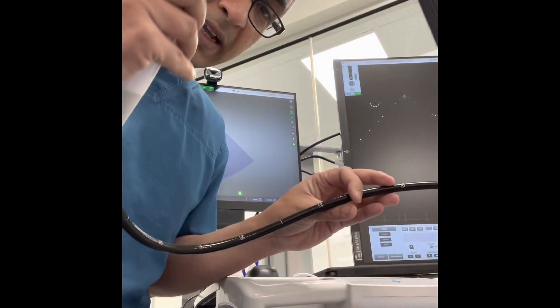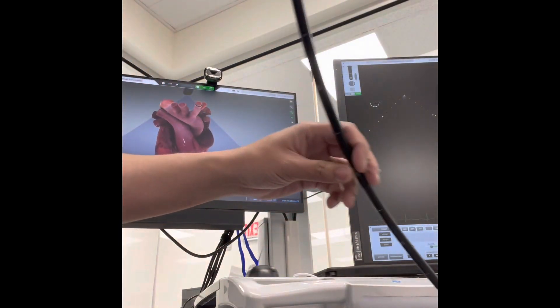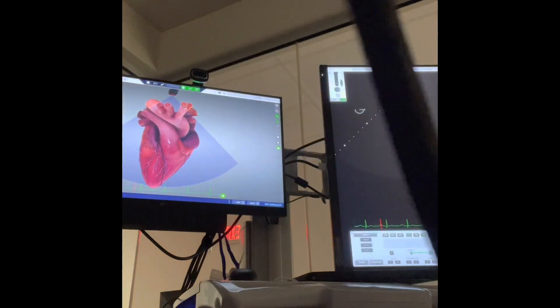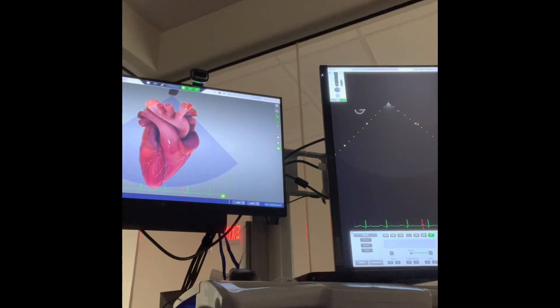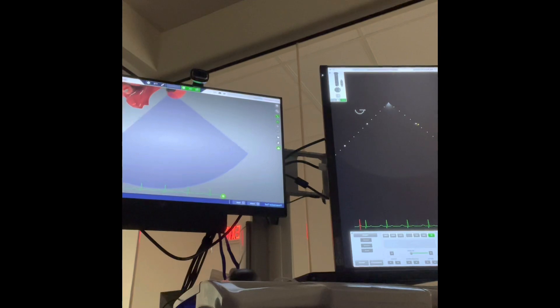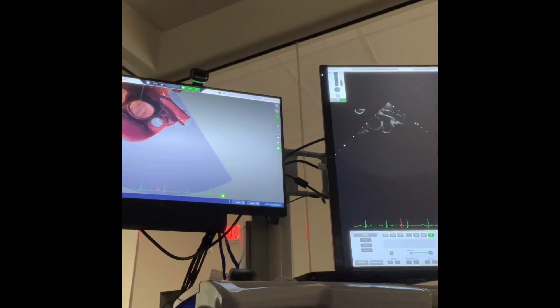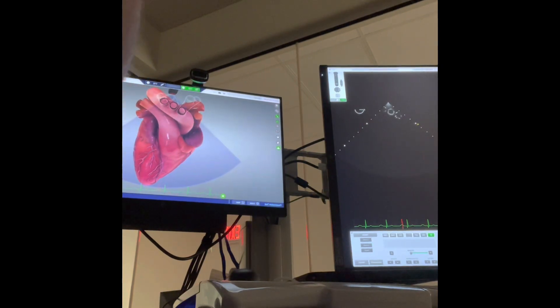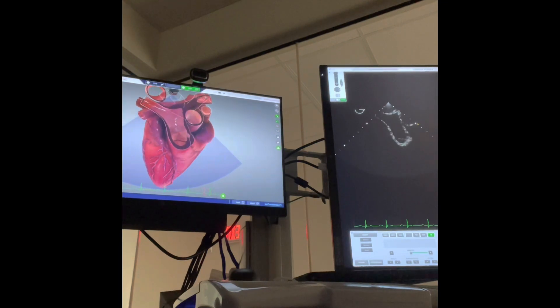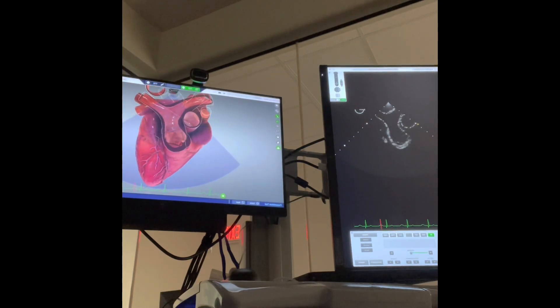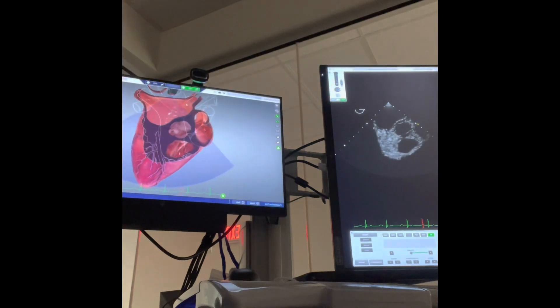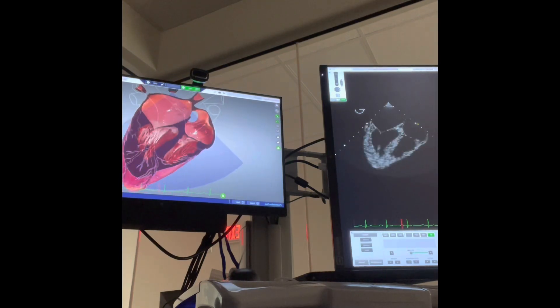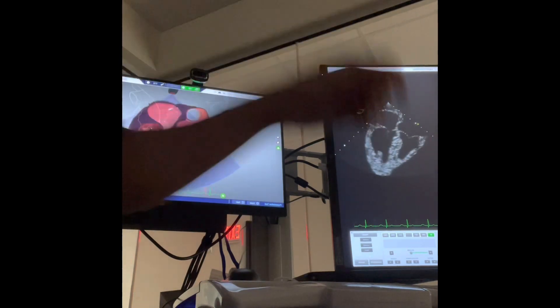Now the best thing about Maya is that I have got a TEE probe. And when I use the TEE probe on her, I start seeing the aortic arch and before that the three blood vessels. And as I go down, I see the root of the pulmonary valve and the two pulmonary arteries. And then I go down and I see the aortic valve. And then what I am looking at is the mid-esophageal four-chamber view and so on and so forth.